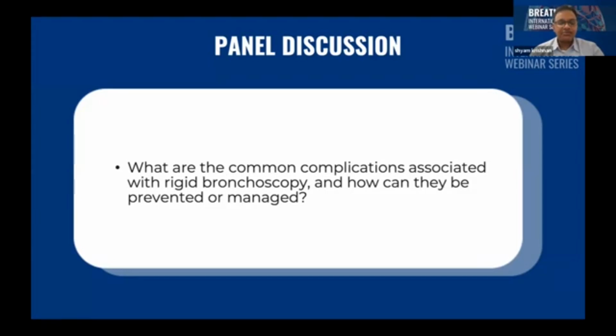So I feel whenever you learn rigid bronchoscopy, if you know the right technique, you minimize most of the complications associated with it. Stick to the basics, learn the technique properly. Like how Byron had said, the position is very important. Choose the scope size correctly.